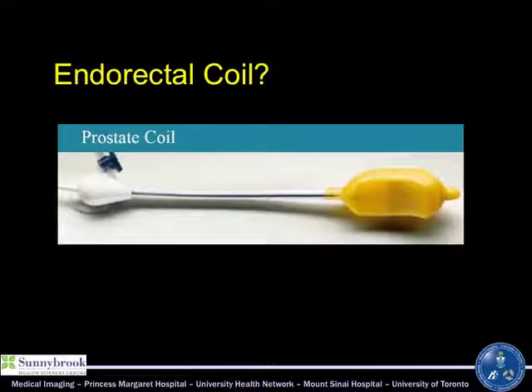This is what the current endorectal coil design looks like. It's a latex balloon. Latex allergies are an issue. There's definitely, I would say, a cultural difference in acceptance. Some cultures, I would say, they just don't want this done. Others are more accepting of the device insertion.